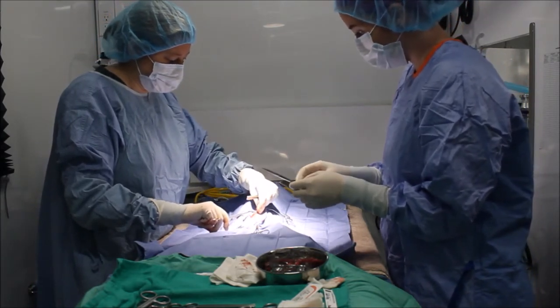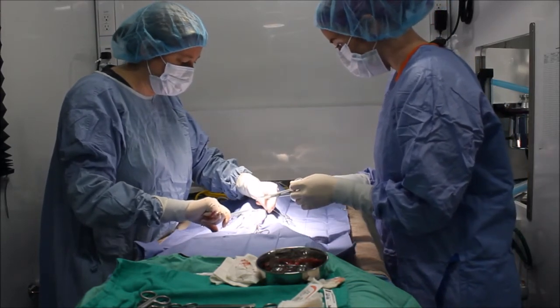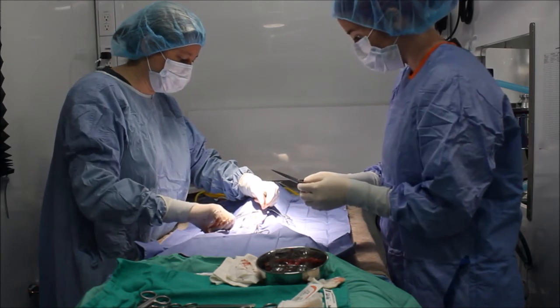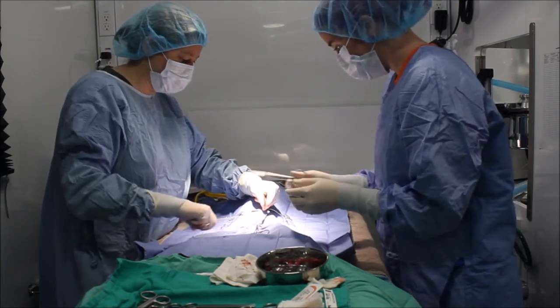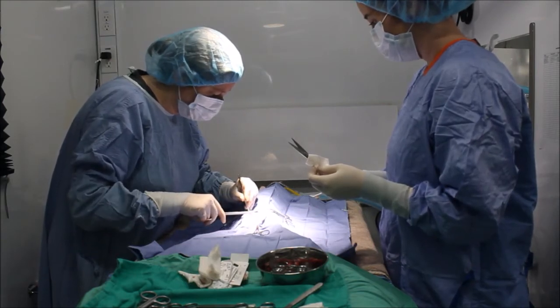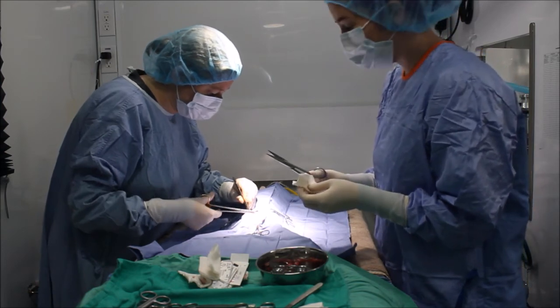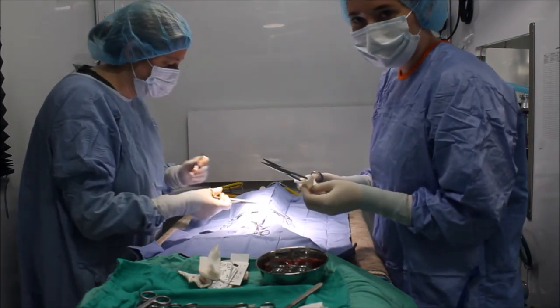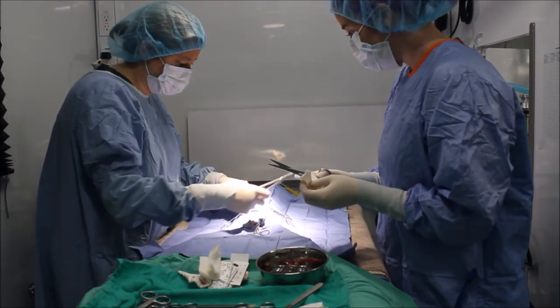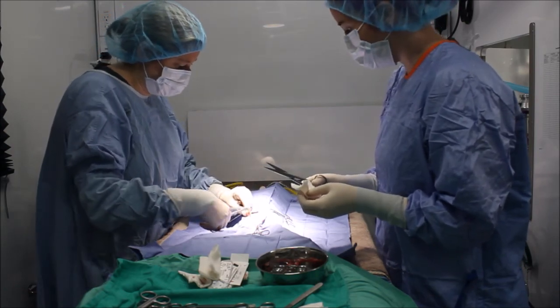I'll cut this, but I'll only cut the top half off — I want them pretty long. As my doctor is finishing up, I'm going to go ahead and continue to cut suture and maintain hemostasis for her so she has a clear visual field at all times.